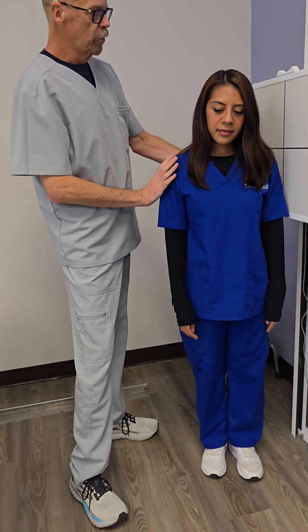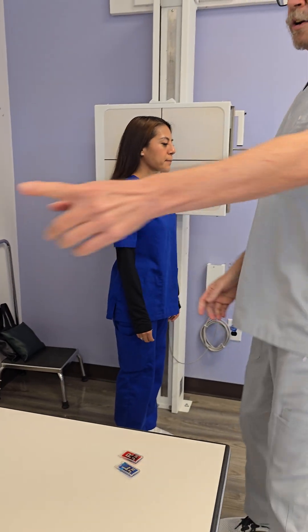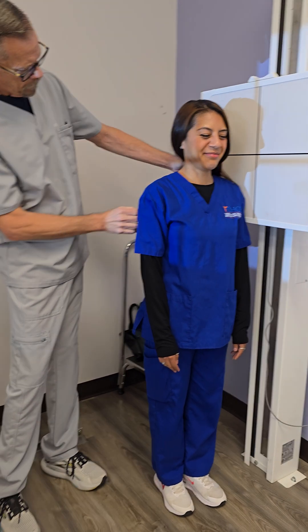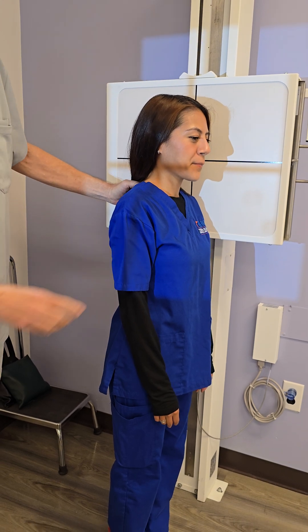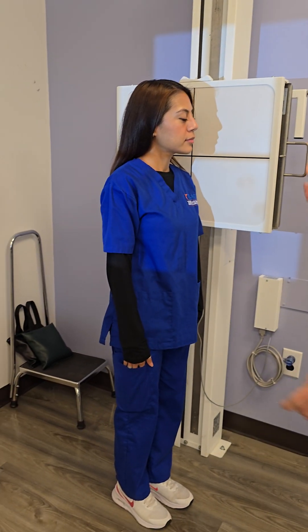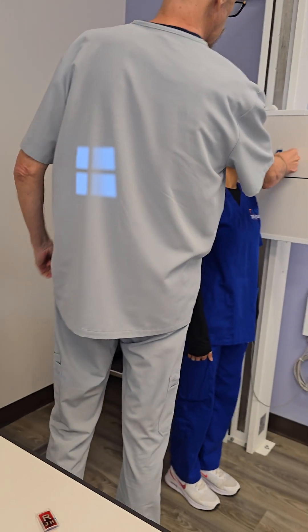We're going to have our left side down, so turn all the way to the left. Pull your hair back. We want to be centered right at about C4, which is about midway of the spine. Scoot forward a little. Be sure your CR and your IR are aligned, and your collimator is set the correct way. We're going to collimate down to the area of interest, which is just the cervical spine. We have our left side down, so we're going to put a left marker on the board.